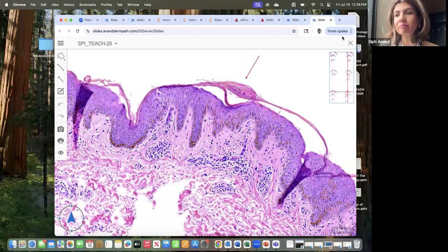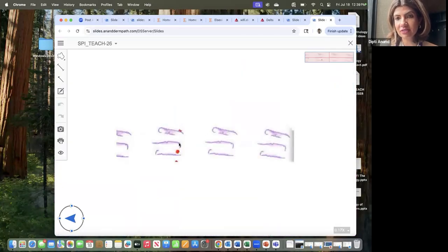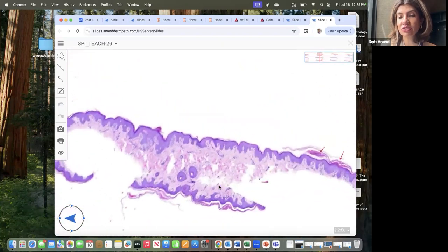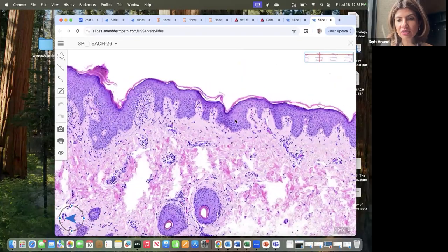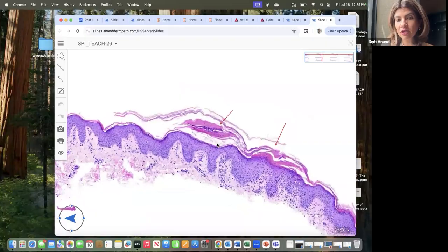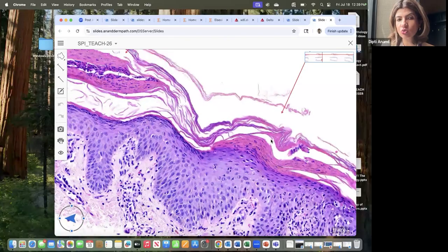Now, whenever you have PR in the differential on histology, you will always have guttate psoriasis, right? The histology of both PR and guttate psoriasis will look the same. The background epidermis looks very similar. You have this nice spongiosis, some slight acanthosis, but unlike pityriasis rosea, you have a mound which is dirty. A dirty mound and a stuck mound. Why is it dirty?